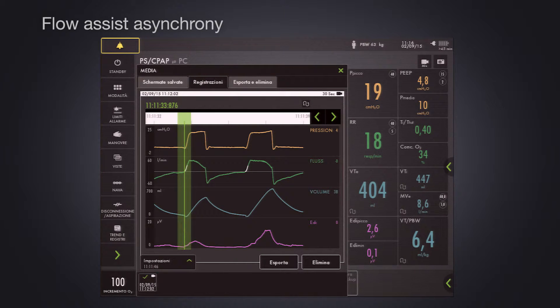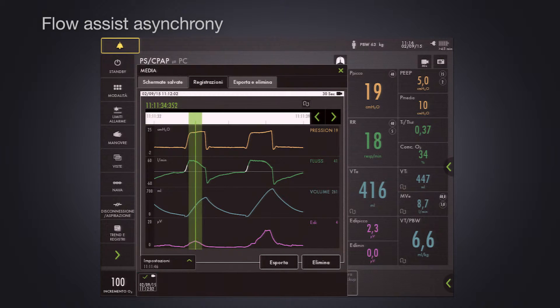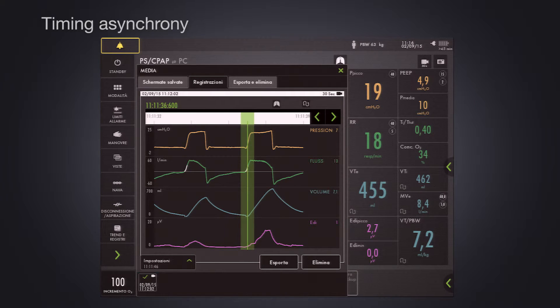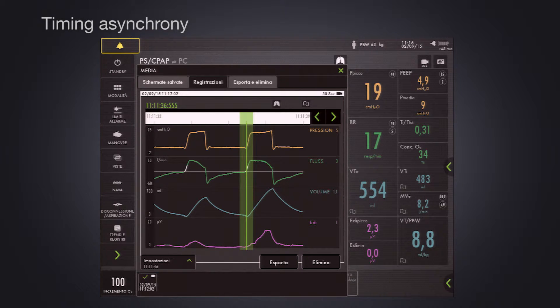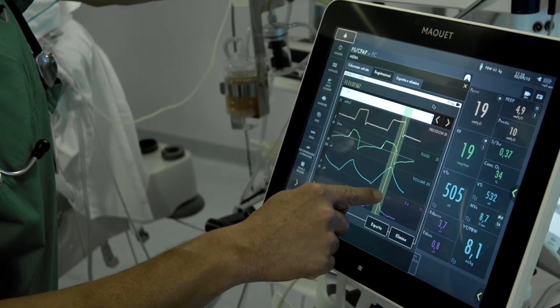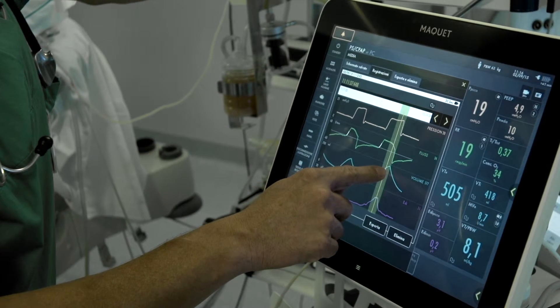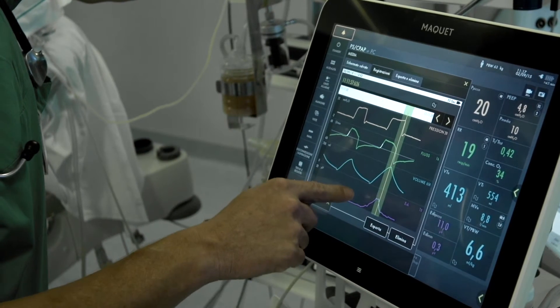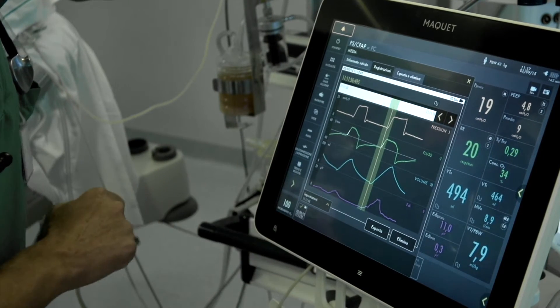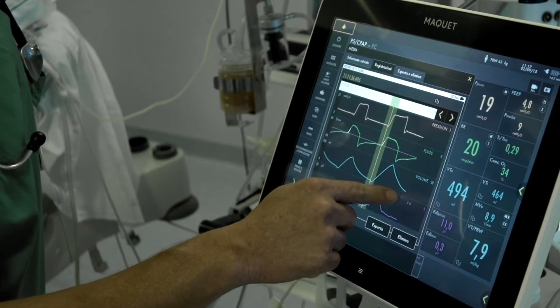Here is an example of flow asynchrony: low EDI but high pressure support delivered. And here is an example of timing asynchrony: the start of the ventilator does not match the start of neural inspiration by the patient. The cycling of the ventilator is acceptable but the triggering is not good enough.